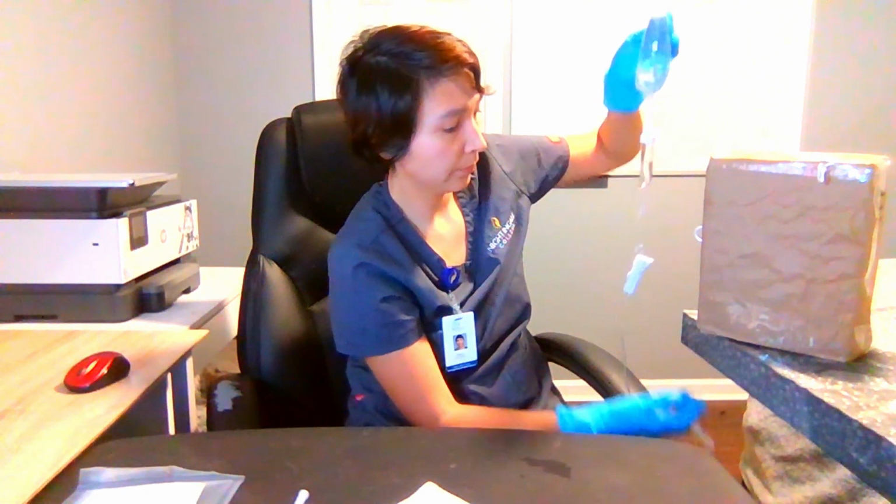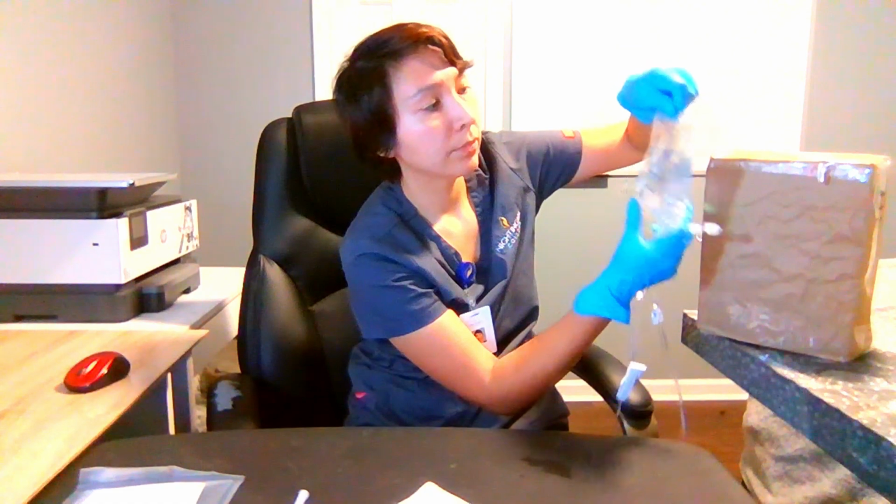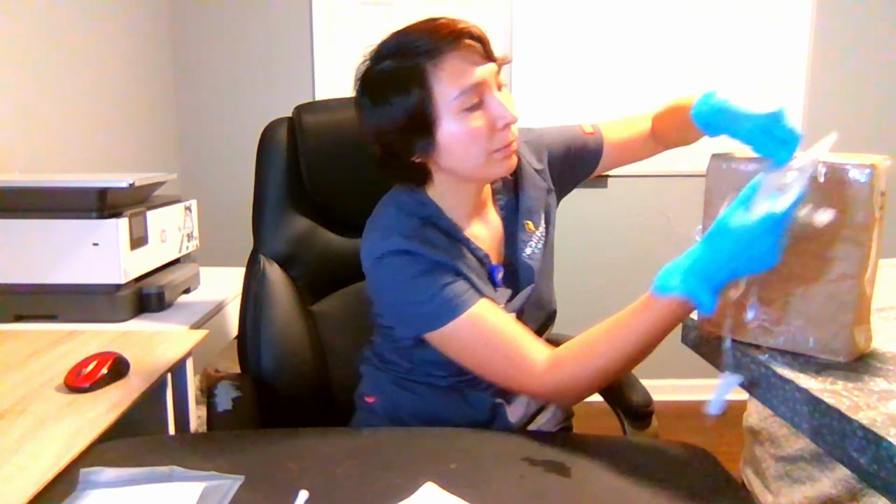There is no more air. There are no air bubbles. I'll now ensure that the IV container is at least 30 inches above the patient's IV site.